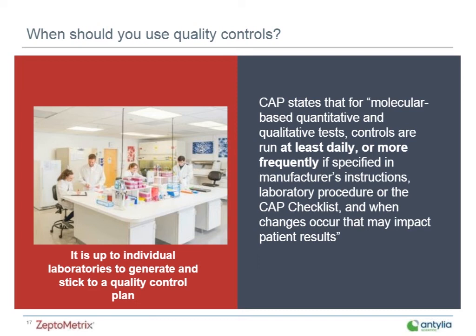You might use a different set of controls, say a quantitative set, when you're establishing a new test in the lab, or you might need something like a verification panel if you're onboarding a new platform in the lab. And then, of course, once you have that platform established and it's passed its verification, you might want to establish a consistent QC regimen with some kind of qualitative pooled control or an external run control to cut down on the number of runs needed. So really, like we talked about a few slides back, it is up to the individual laboratory to generate and to stick to their quality control plan.